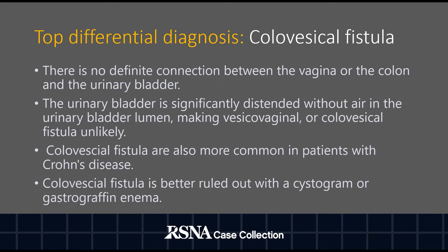Another differential diagnosis to consider is colovesical fistula. Here there is no definite connection between the vagina or the colon and the urinary bladder. The urinary bladder is significantly distended without air in the urinary bladder lumen, making vesicovaginal or colovesical fistula unlikely. Colovesical fistulae are also more common in patients with Crohn's disease and are better ruled out with a cystogram or gastrografin enema.